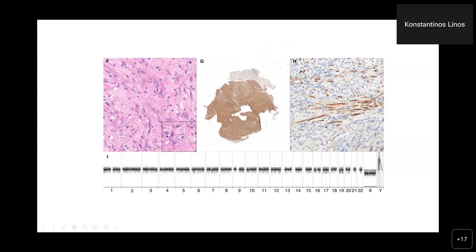And this tumor, which has a characteristic voluminous eosinophilic cytoplasm as well, has very characteristically diffuse strong CD34 positivity. Not many tumors do that. CD34 is a very non-specific stain. It stains a gazillion different tumors, but a stain that consistently and recurrently stains a tumor wall-to-wall, diffusely and strongly, is not that common. And very commonly, these tumors have multifocal positivity for keratin, which is common in sarcomas or in mesenchymal tumors. It doesn't necessarily mean it's carcinoma or sarcomatoid carcinoma.